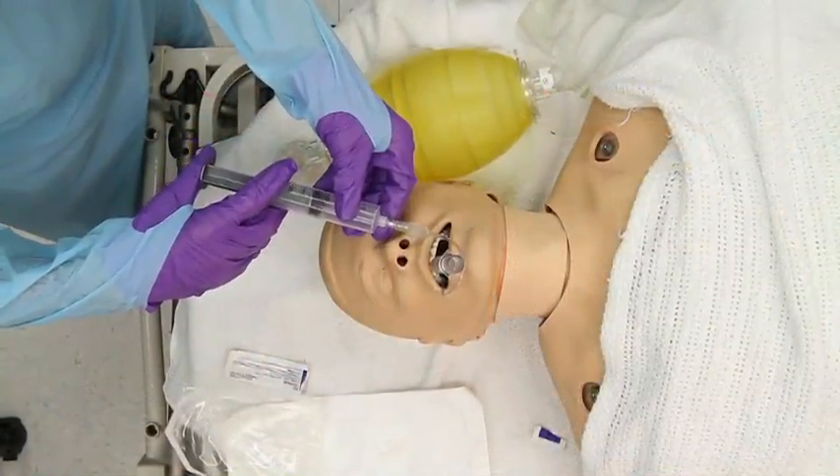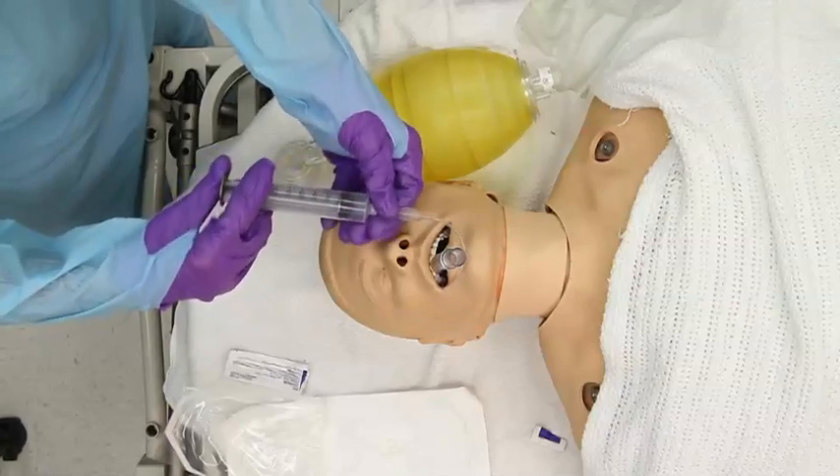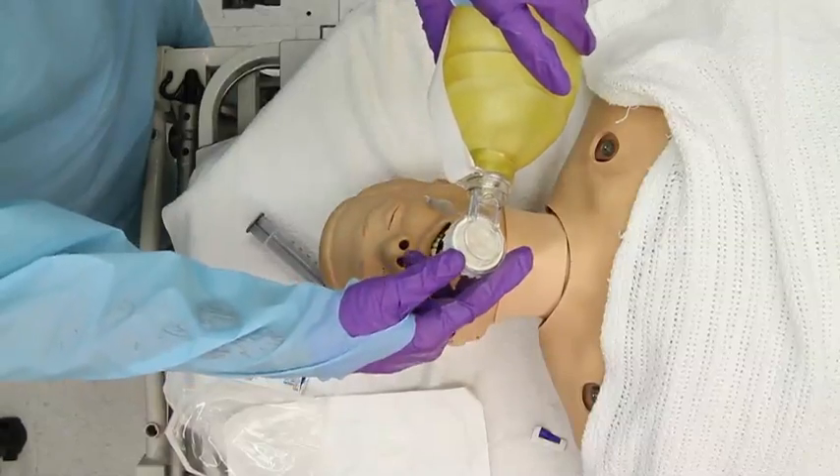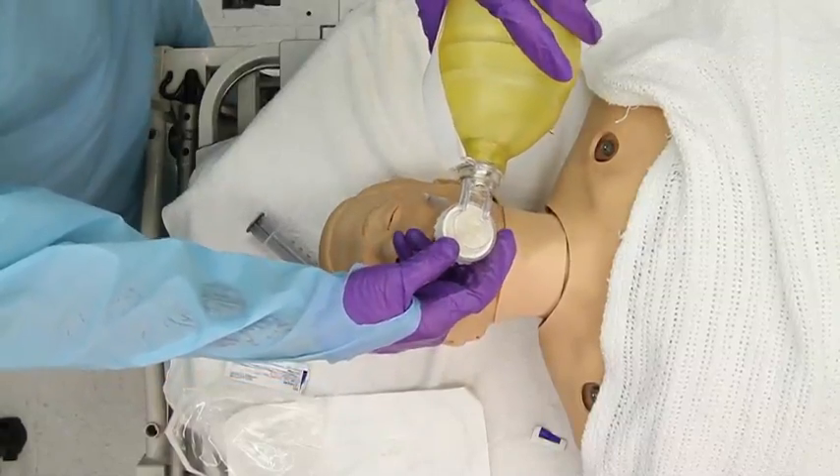Inflate the cuff with the correct volume of air as indicated on the shaft of the LMA. Check the placement of the tube by observing chest excursions with ventilation.